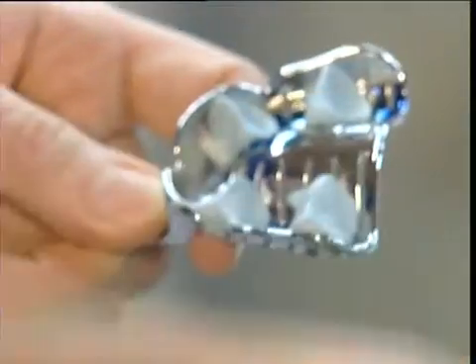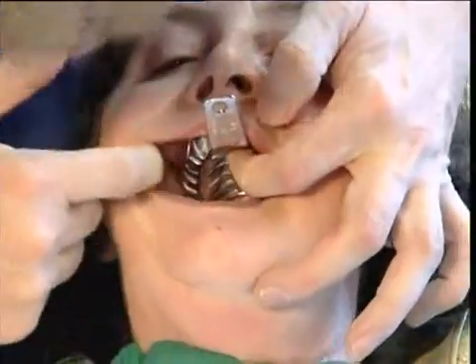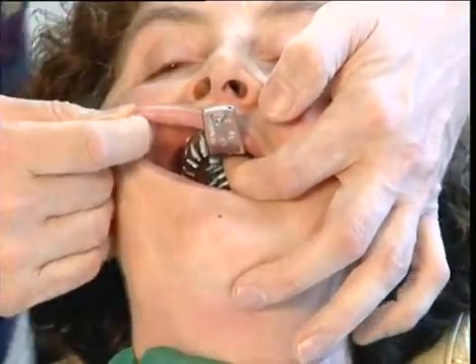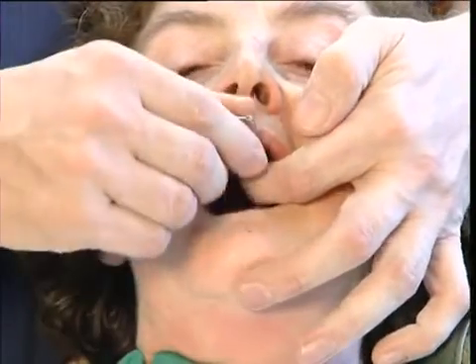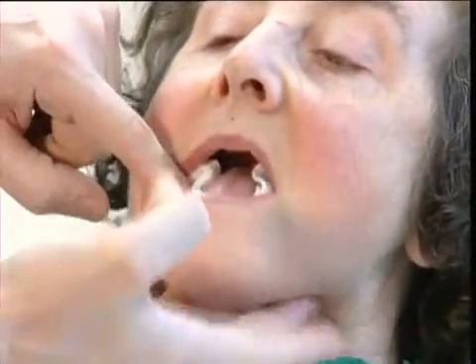The stops are placed in the upper tray, posterior region teeth 4 and 7, as well as the palatal vault. The gauze is removed and the tray inserted immediately. The same type of preliminary impression is taken of the mandible, using the same criteria.